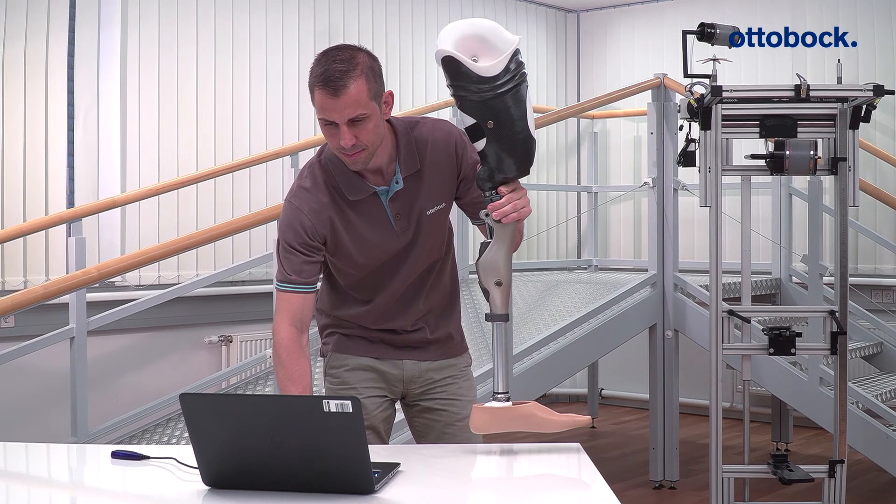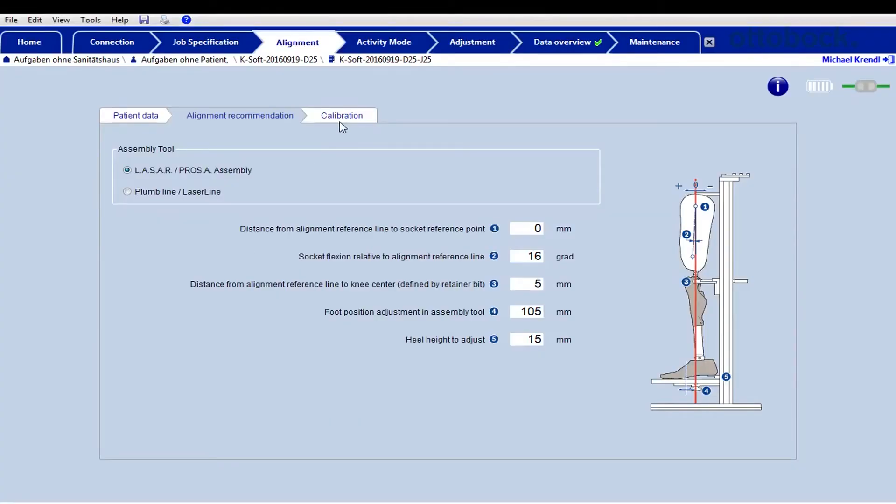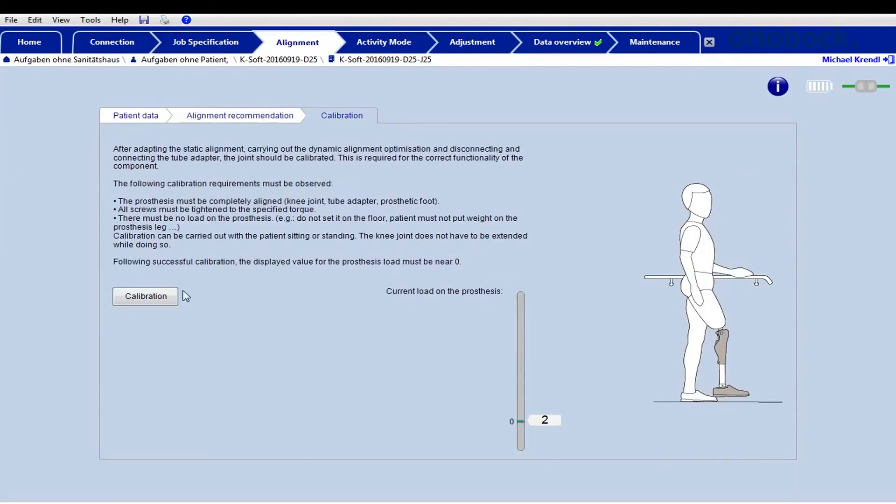Calibrate the joint by holding the prosthesis in the vertical position and pressing the calibrate button in the software. There must be no load on the prosthesis during calibration.